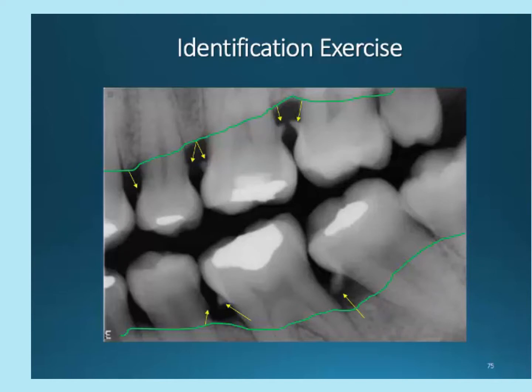I am not noting any carious lesions in this radiograph, but the calculus is extremely large and obvious, and the bone has receded away from the area of calculus. Even though we are not noting calculus beyond that point, most likely these are still areas of calculus layering the sides of the teeth.